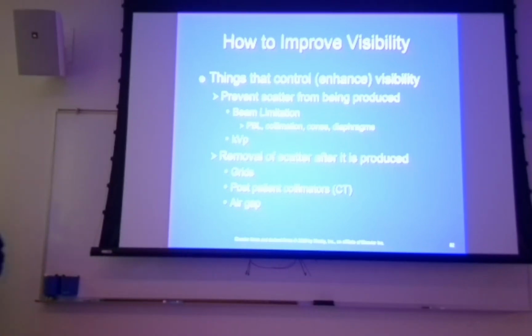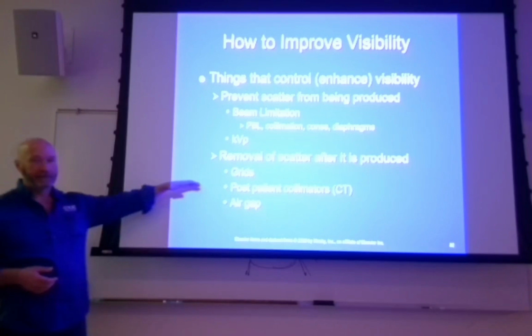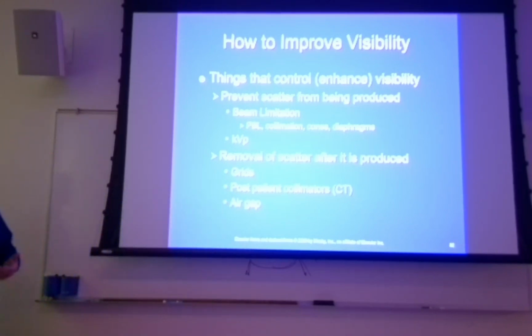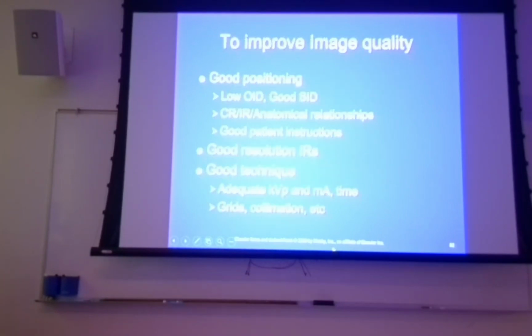So I think they'll dial those in. Do I think the grids will eventually completely go away? Maybe. I don't think anytime soon, but maybe, if they can make the virtual grids that much better.